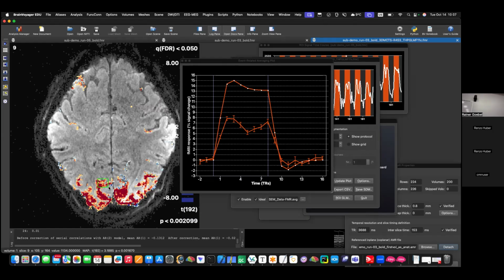Sorry, the idealized time course seems to be changing quite a bit in scale between one region and the next, and I'm wondering why. No, the idealized one is always set arbitrarily, just randomly. It's just to have some variability. So you care more about the correlation as opposed to the actual size of the thing? No, it's just informative.